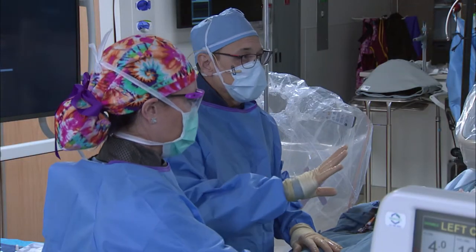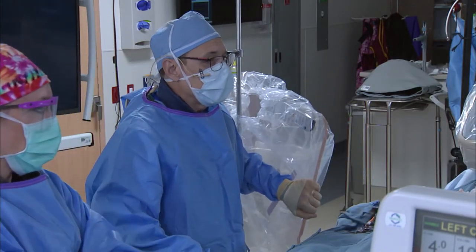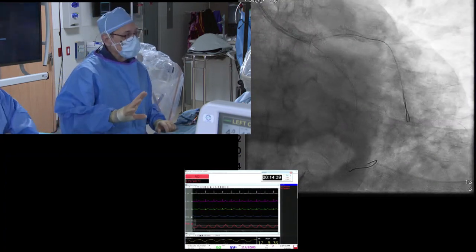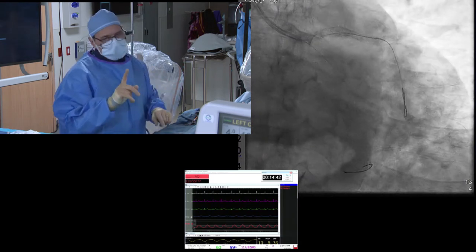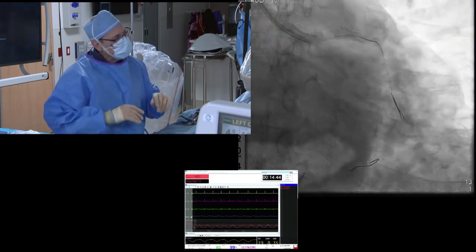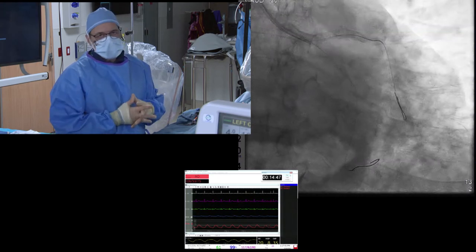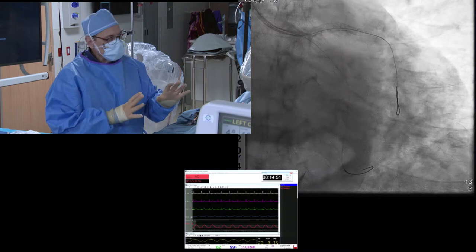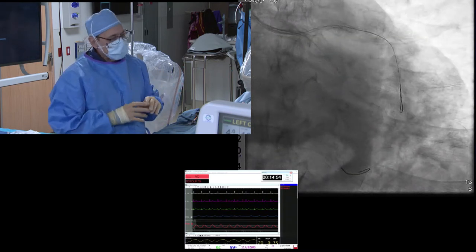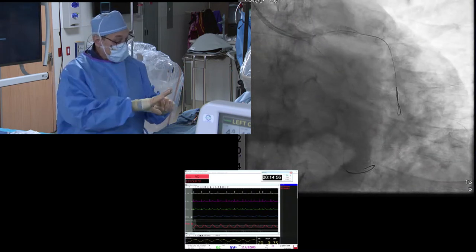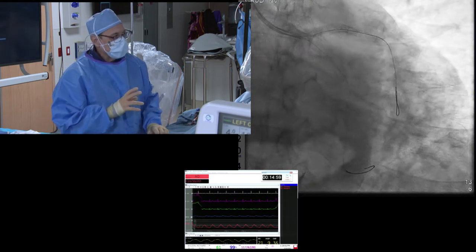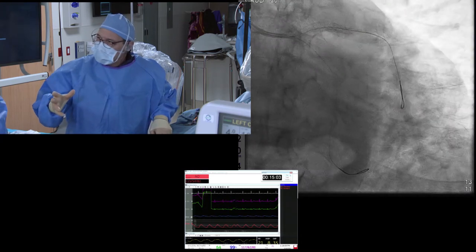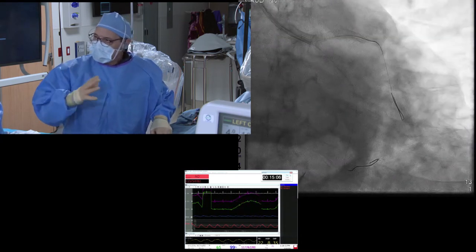We've got our wire through the lesion in the LAD — it was really kind of challenging to do that. Because there may be ostial disease, I got a 7.5 French catheter in, so there is no downside to protecting the circumflex. We had a little damping of the pressure waveform, but now the waveform looks great. I'm going to protect both branches — good technique if you're worried about plaque shift when working near the left main.